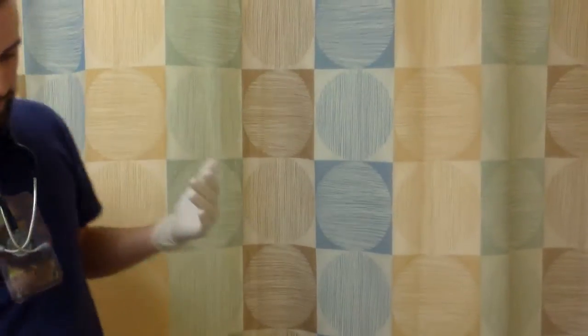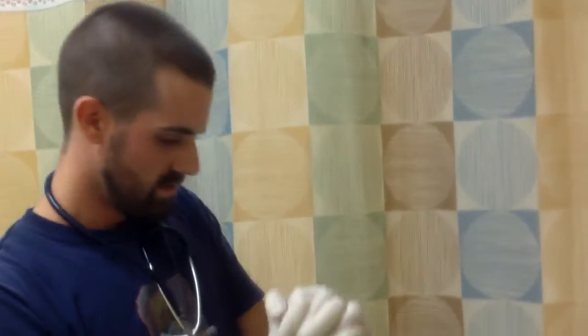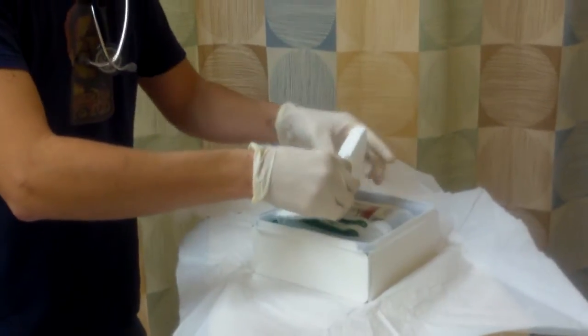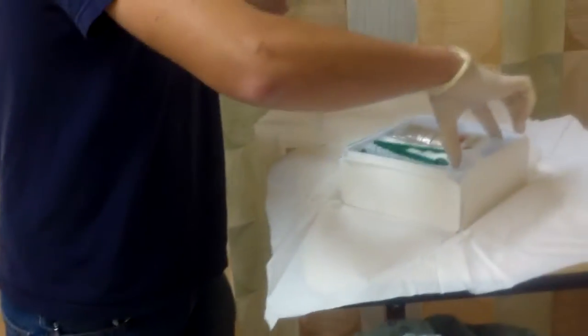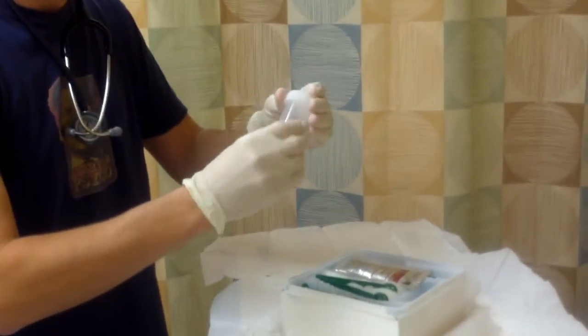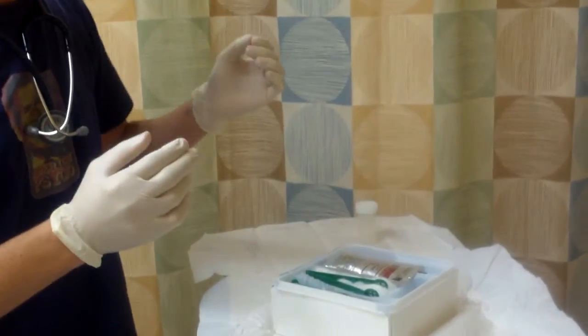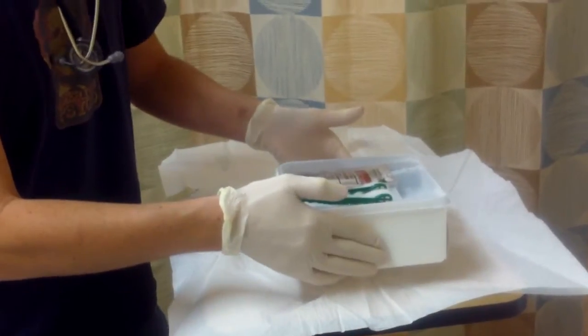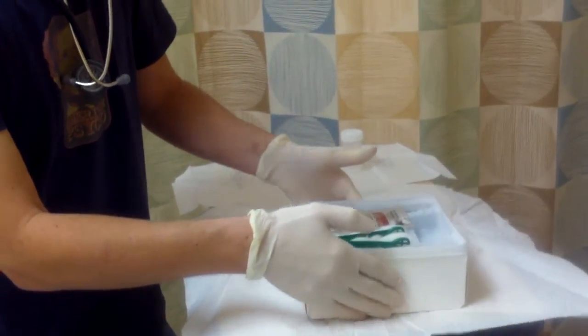Okay, good. So now that I have my sterile field and my sterile gloves, I need to manipulate my stuff in here. So then I'm going to take out this. I'm going to set this on my sterile field, so that's sterile. I'm going to take out my specimen container. Do not need this for this video. I'm not going to collect a specimen, so I'm going to set that aside. I'm going to pick up my box and put it near the edge, but not the contamination edge.